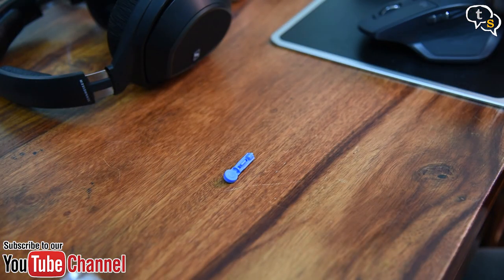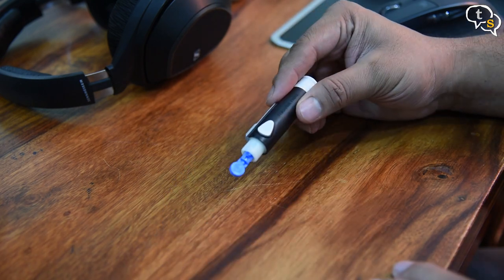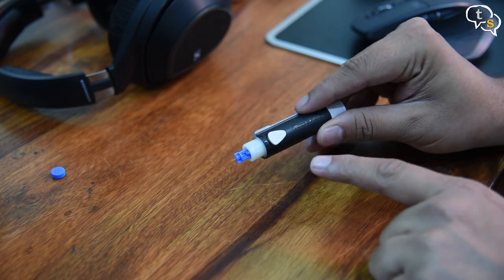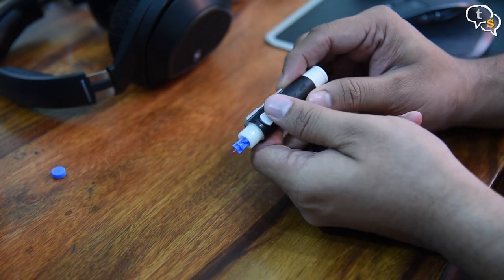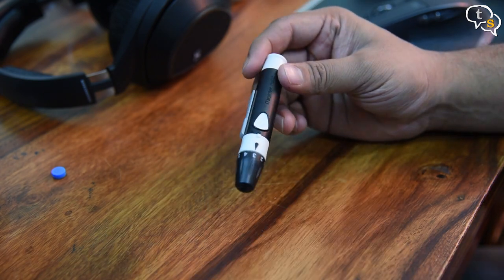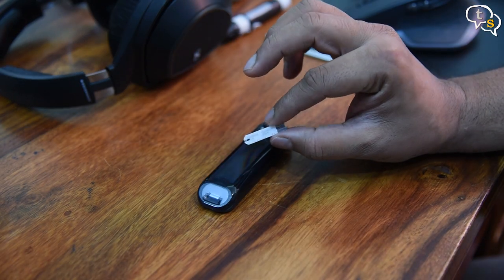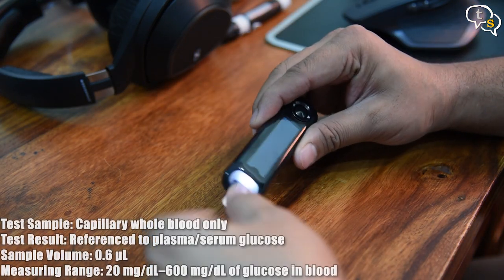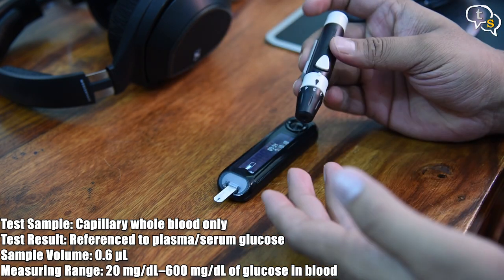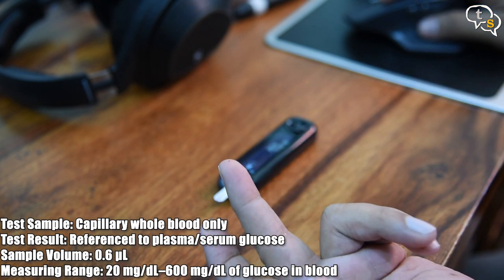Let's now actually test the device. Open up the microlet, break away the circular protector over the microlet and place it in the lancet. Close it. When you pull back on the handle, it makes the lancet ready to pierce. To test, we need to insert a test strip on the left slot with the gray chip side up. Now we need to draw the first blood, so I used the lancet on my finger and a small blood droplet formed in the area.